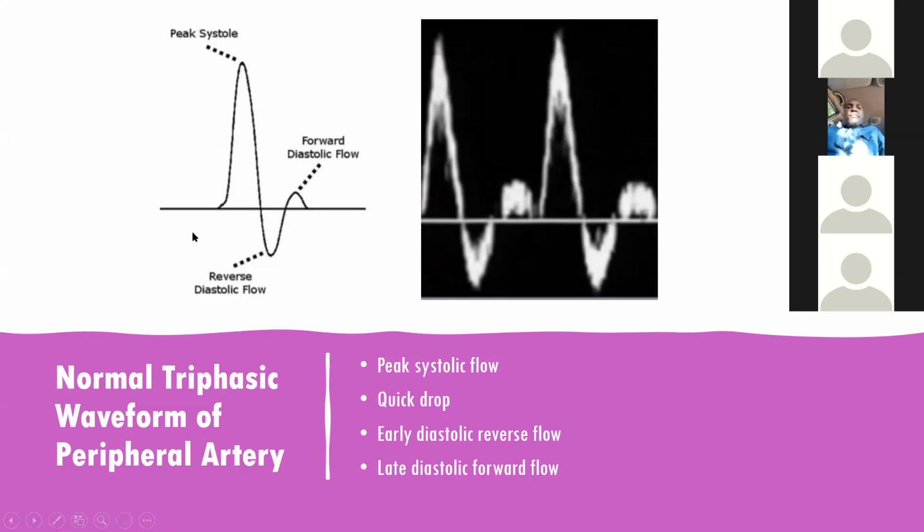The reduced flow depends on the degree of stenosis, and depending on this degree of stenosis, you will see whether the spectrum of the blood flow is biphasic or monophasic. With increasing reduction of flow, you will get biphasic, then monophasic, then what is called tardus parvus flow. And these are the things that will tell you the severity of the stenosis.